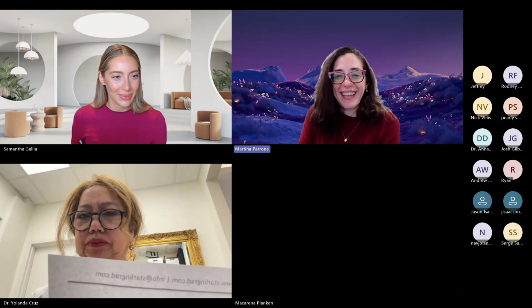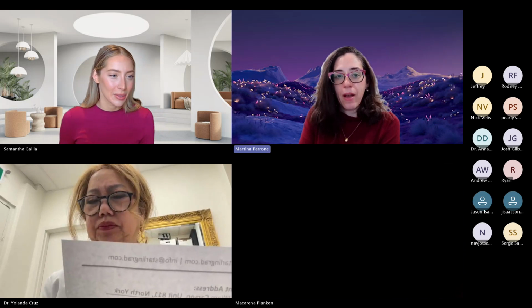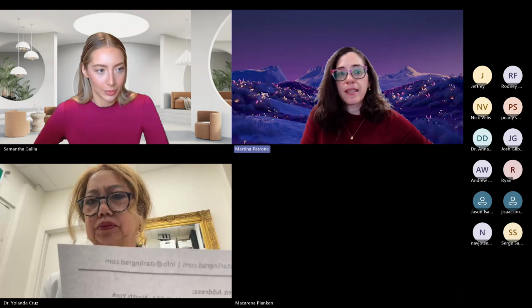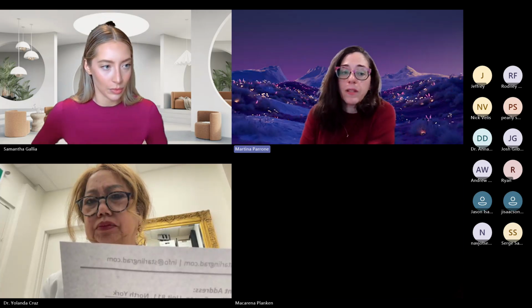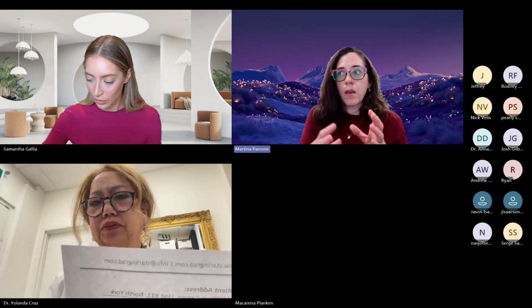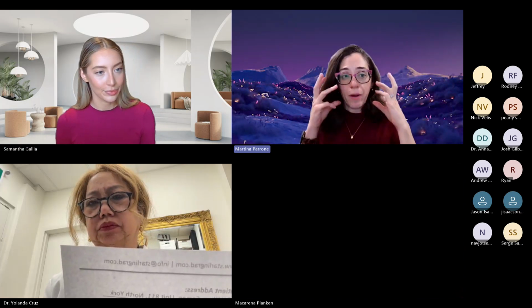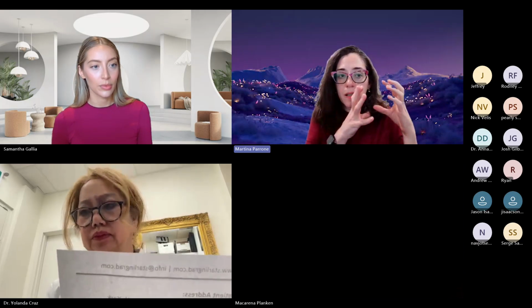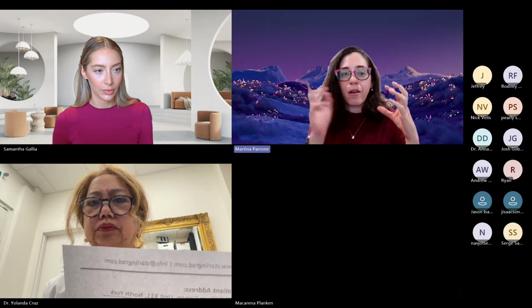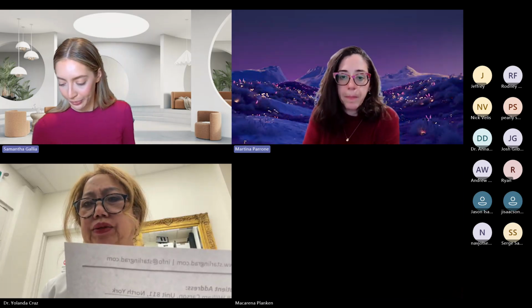Artifact's a tough one. They're coming out with newer, better algorithms to try and alleviate that. The biggest thing is smallest field of view will reduce the artifact. So if you're taking a CBCT of someone's mouth and they have restorations everywhere, you want to really collimate your beam as small as possible so you're not getting artifact from all the other restorations in there. So smaller field of view is better.